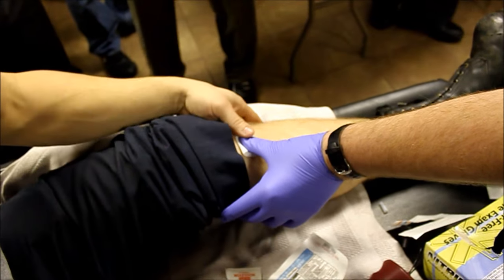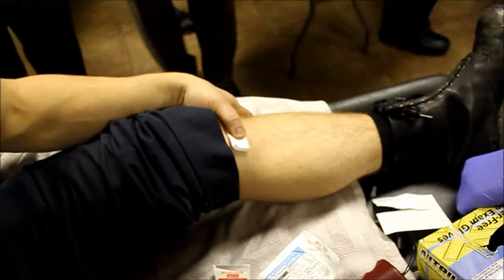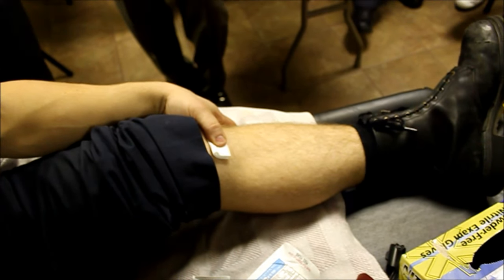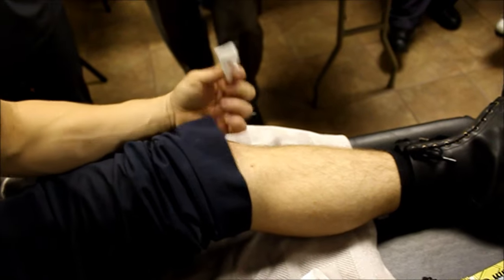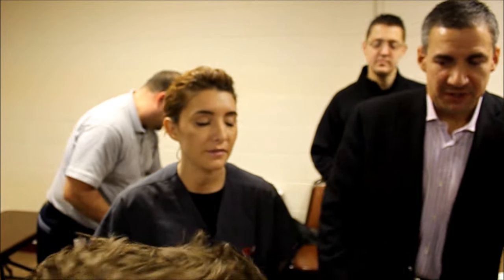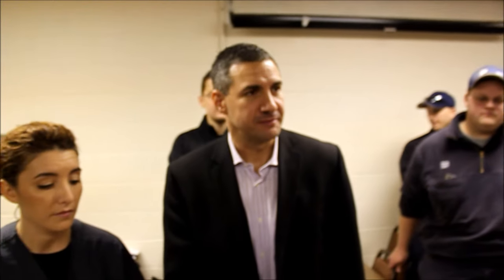Hold that right there. How you feel? Good. Put a little pressure on there in front of it and a band-aid — it's not as bad. I wasn't really sure about feeling it go through, but it's pretty odd. It takes a little bit longer when you're doing it on somebody real than doing it on the practice bones, but you still feel it. Try the humerus first. The proximal tibia is a good second choice, and then the distal tibia as kind of a third option, a last resort.